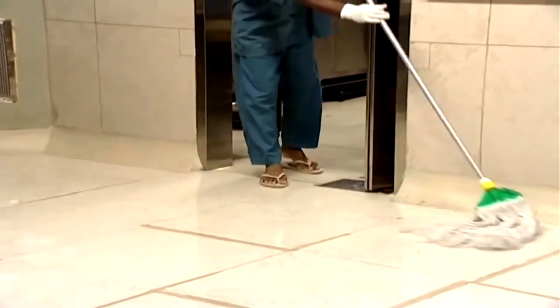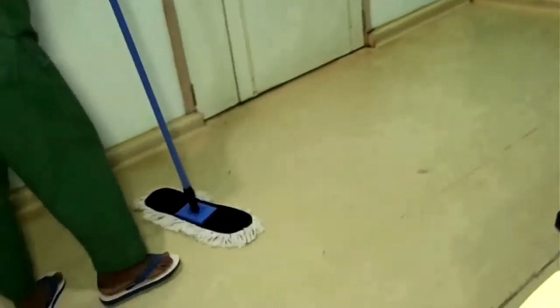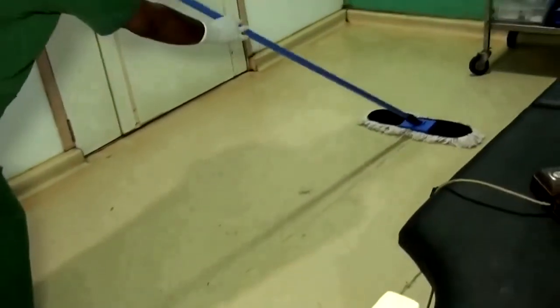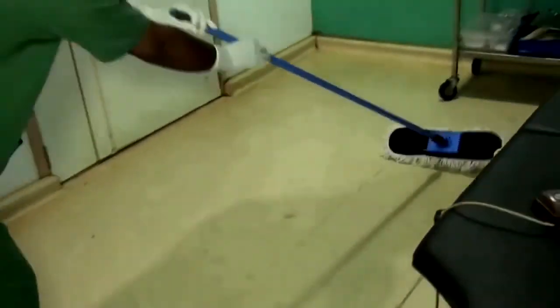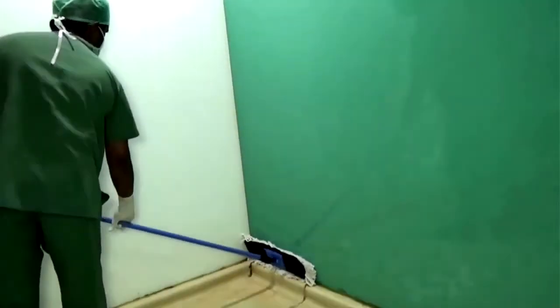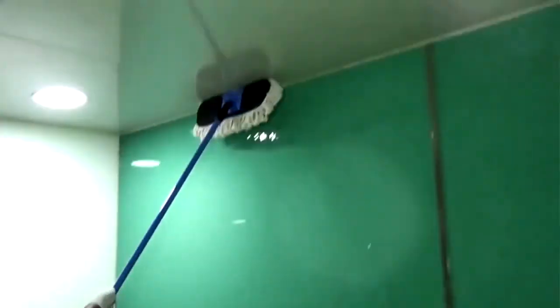This is the proper way. And leave the theater closed for the specific time. This is using a mop. It's easy for you so that it doesn't hurt your back bending, and you can reach even to the top of the wall. Unidirectional way of wiping.